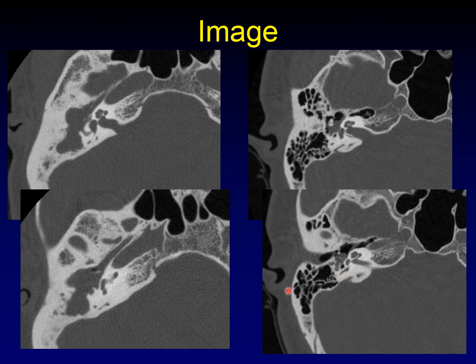In patient number one, the lateral semicircular canal has been eroded. In patient number two, there's no evidence of erosion of any of the inner ear structures. In patient number one, the mass is indistinguishable from the facial nerve canal. In patient number two, that's still true — the mass is indistinguishable from the facial nerve canal, as if it were eroding into or possibly emerging from that canal.